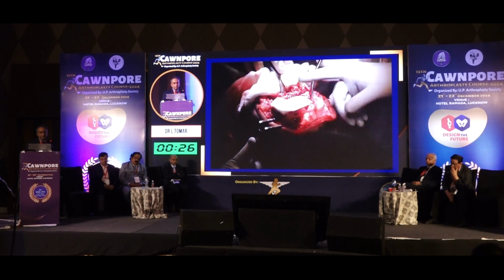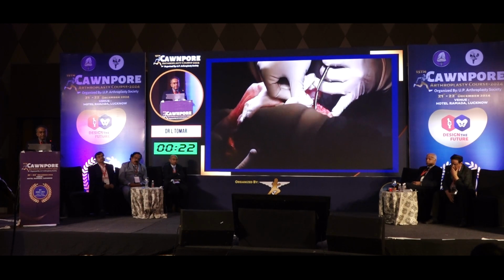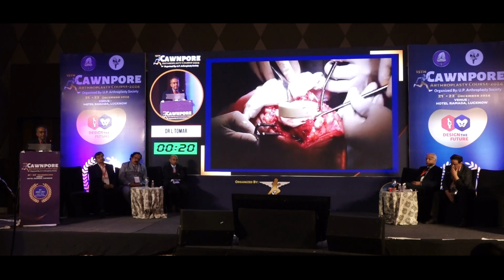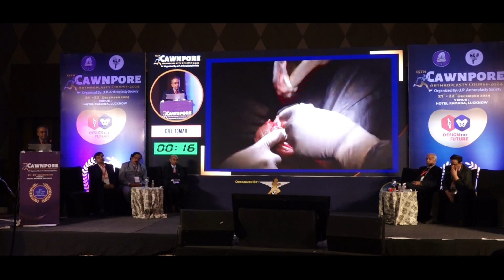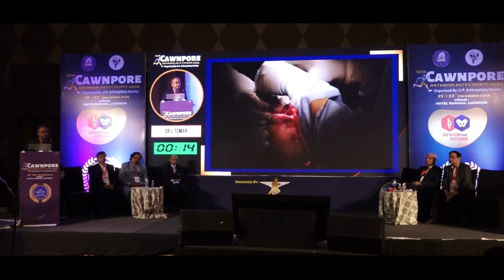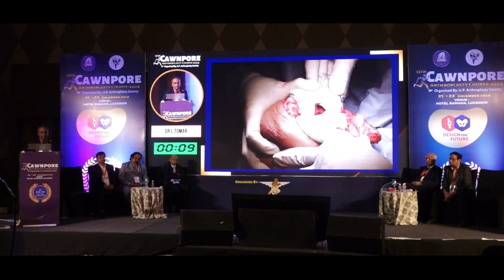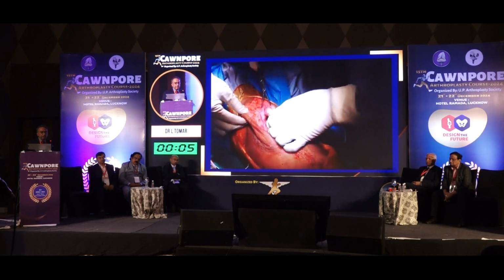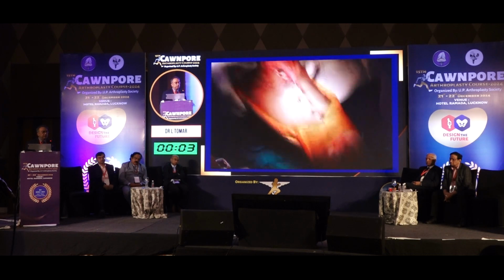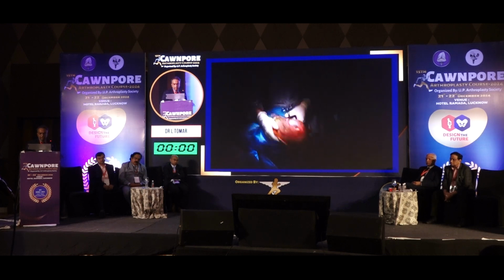Then we apply the antibiotic loaded cement again, but this is very poor cementing, never in the intramedullary canal, only on the surfaces, and in a doughy state over the tibia and the femur. This gives a little stability, but can be removed easily when it has to be removed. In the same way, we straighten the joint, look for patellar stability, and remove the leftover cement. Then the wound is closed over the drain.